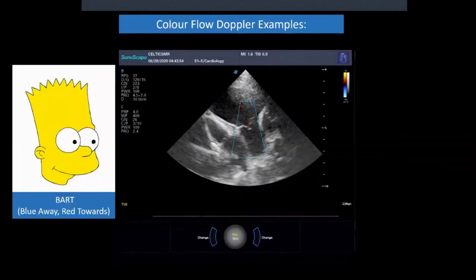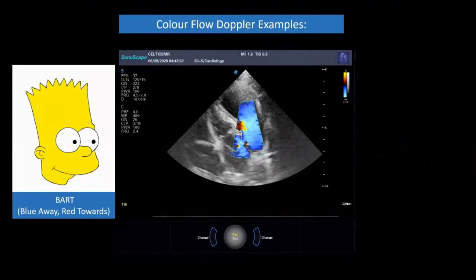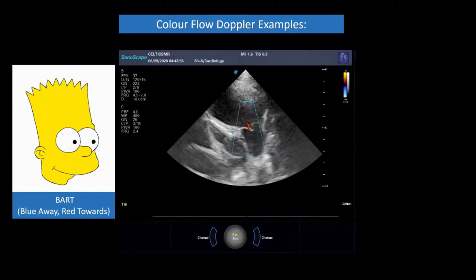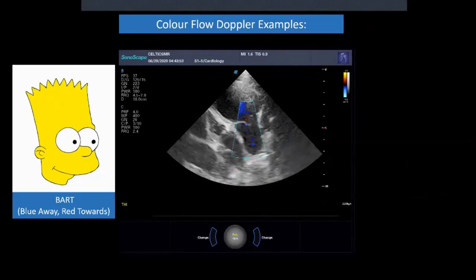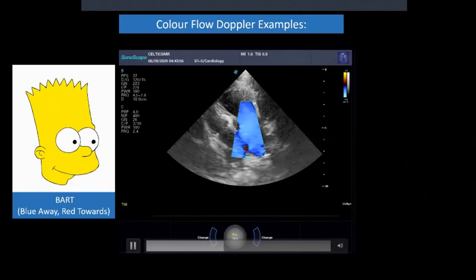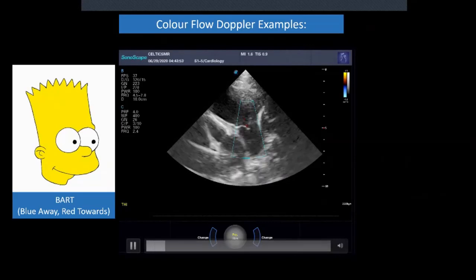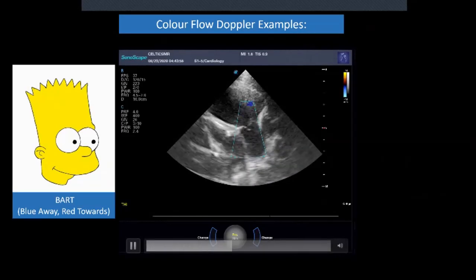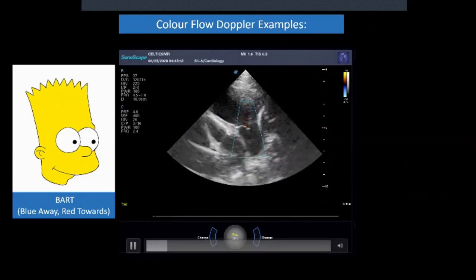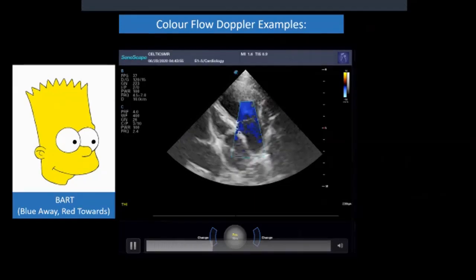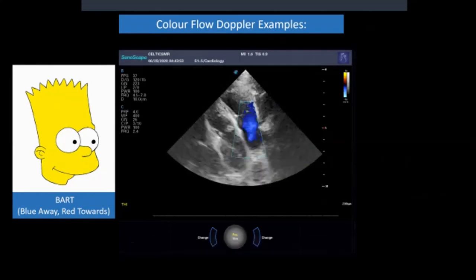Here's another one of her valves, which is leaky as well. You can see blue — remember BART, blue away, red towards. Blue is flow going down this artery, and red is blood heading towards the probe. So you have systolic flow and diastolic flow, with a little bit of insufficiency in that valve — you can see that little red flame. Here's a normal aortic outflow from a right parasternal long axis view. Blood flowing away in a general direction, getting further from the probe, so it's blue and looks quite laminar.